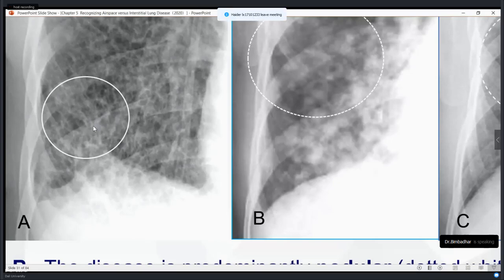When you follow the bronchial tree, the right main bronchus comes down into the periphery. They don't go in a randomized pattern. They go in a tree pattern, and it is obvious that most of the bronchuses are not visible, but the interstitium has become visible right now.